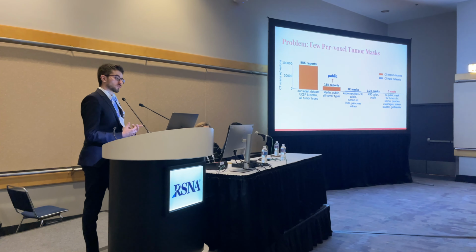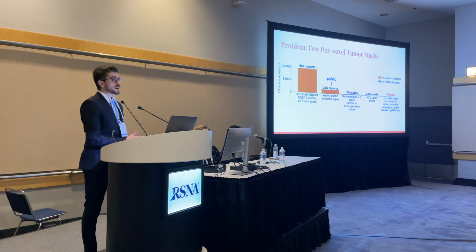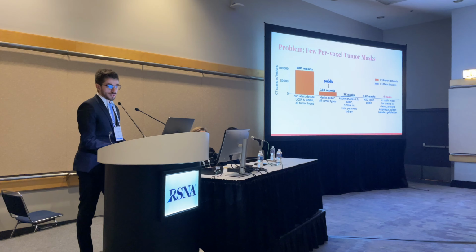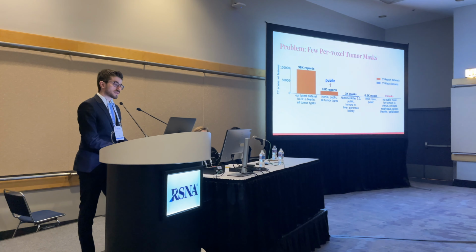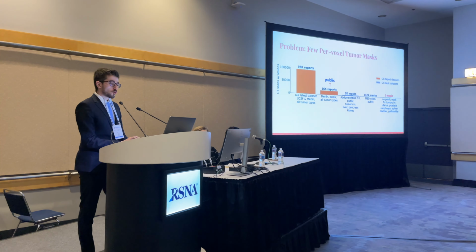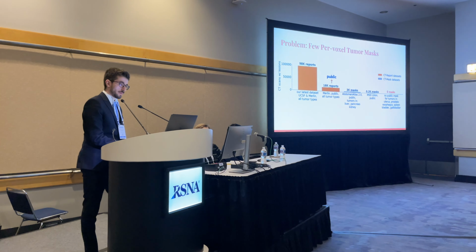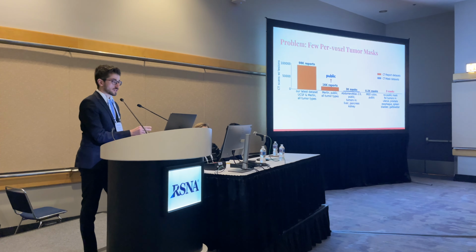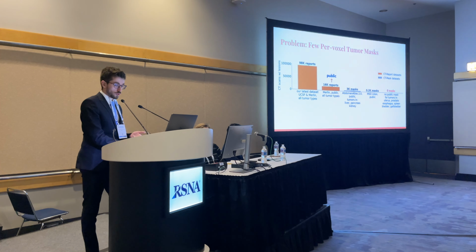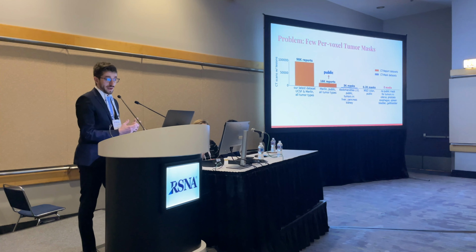So we look for another type of annotation, which are the radiology reports. Unlike masks, which are basically only created for research, reports are written every day by radiologists. So you can find public data sets, like Merlin from Stanford, that has 16,000 CT scans with reports. Reports about tumors, which cover all these tumor types, unlike the masks. And one single hospital, like UCSF here, can offer us about 100,000 CT scans and reports. So you can see in this plot that the difference between reports and masks is massive.